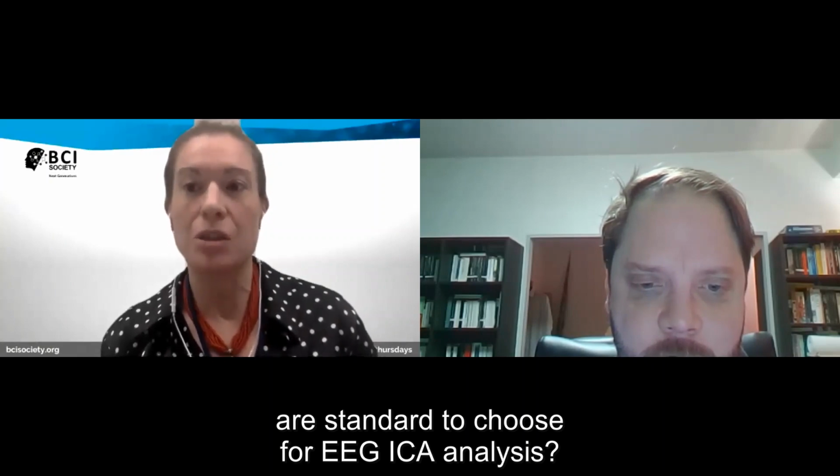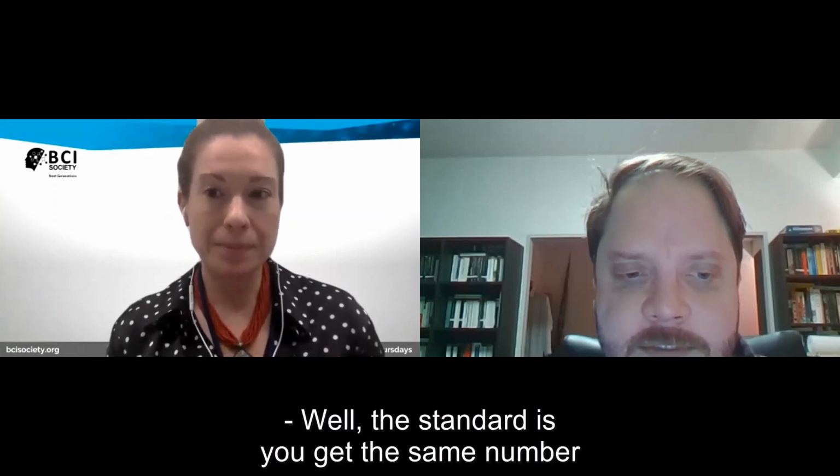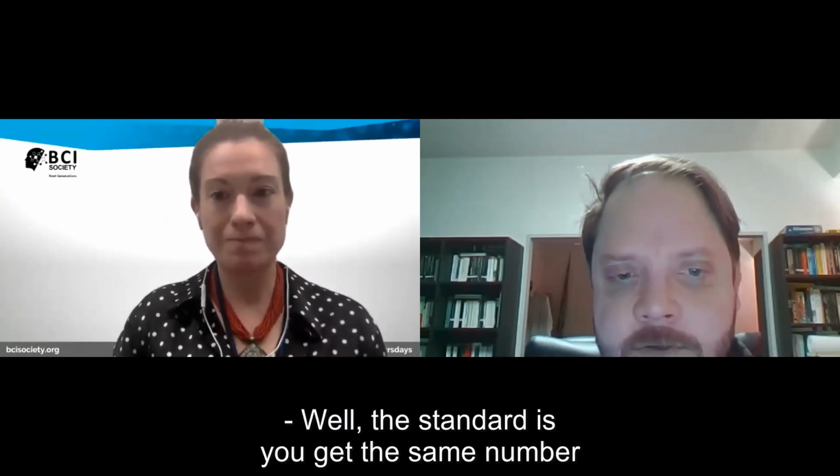Okay. Another upvoted question was, how many IC components are standard to choose for EEG ICA analysis? Well, the standard is you get the same number of ICA components as you have number of channels.